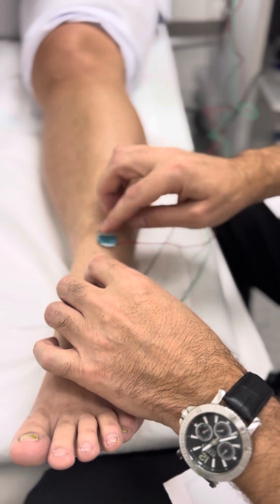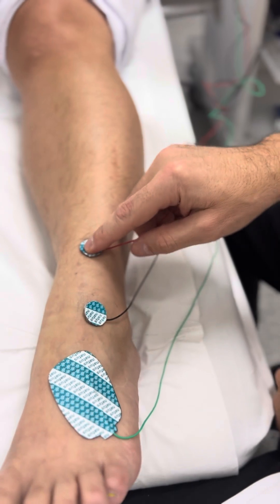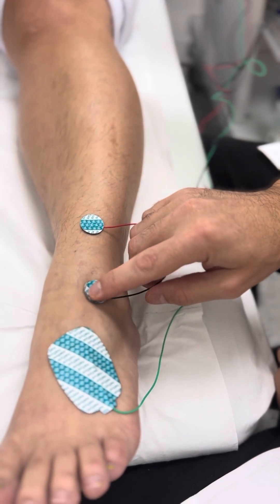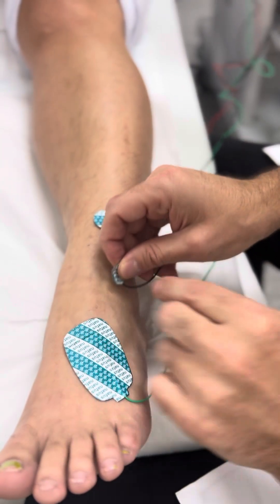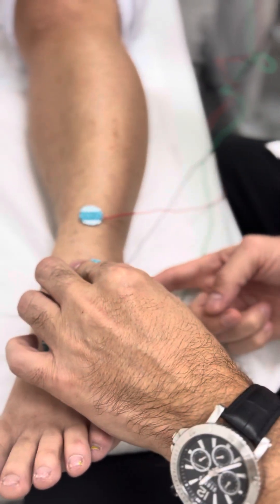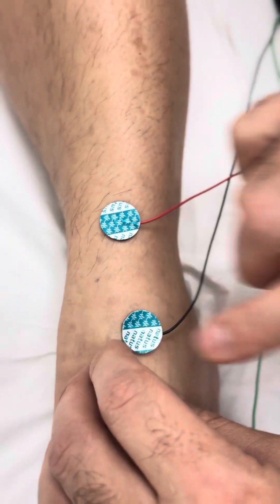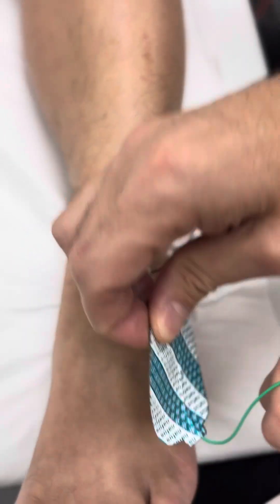We have the electrodes that we place. This is the reference — the red one and the black one. The black one just above the malleolus. The sural nerve is behind it, but the superficial peroneal is above the malleolus. And we have here the ground one.